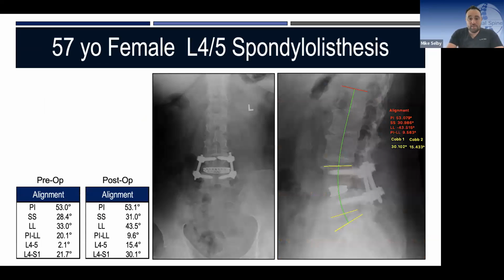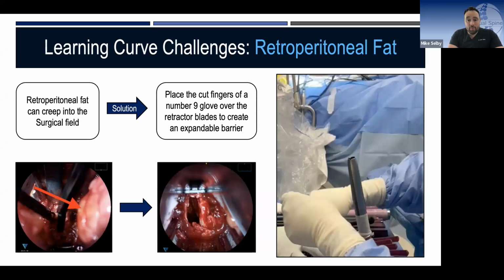Yeah, Ashish, I love this technique. I think it was because I had the same issue with you. I've never seen bowel during this, but certainly have seen some bowel during laterals previously, particularly with scarred retroperitoneum. The peritoneum itself is a very thin structure, right? And it does reform, and it's more about recognizing when you're through it than being too worried about it. But obviously, if you get bowel coming into your field, it's a huge issue. So I love this technique.